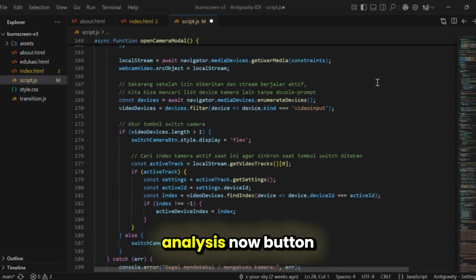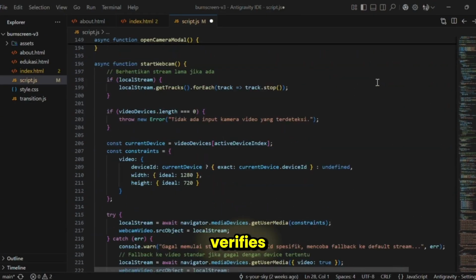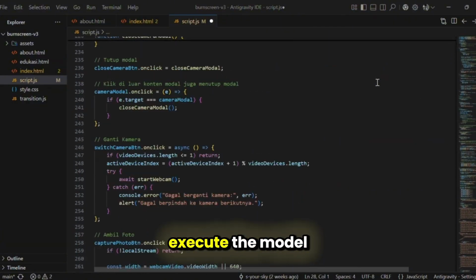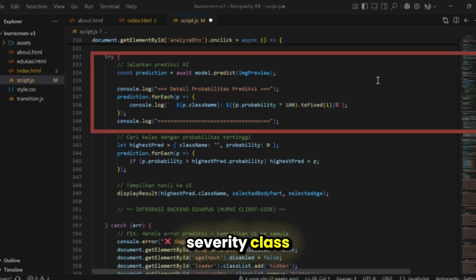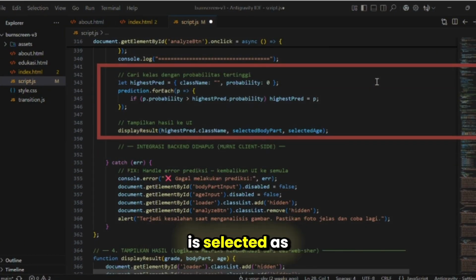When the Start Analysis Now button is clicked, the application first verifies that the machine learning model has been successfully loaded. It then executes the model predict function to generate prediction probabilities for each burn severity class. The class with the highest probability is selected as the final classification result and passed to the displayResult function.